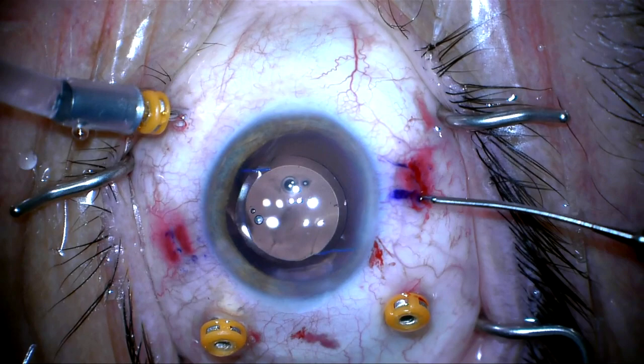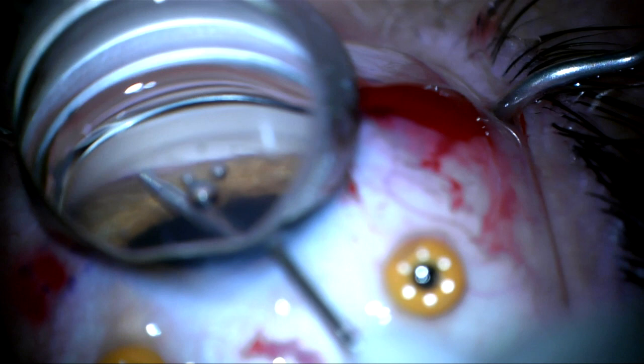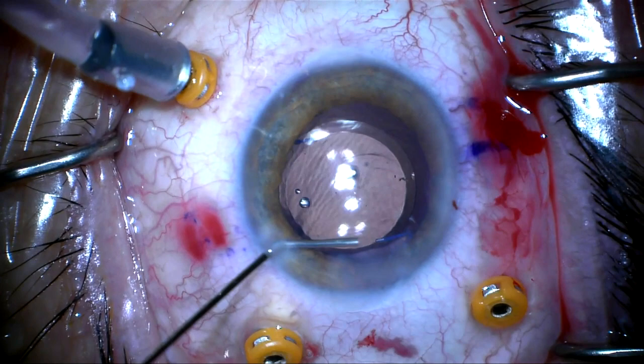I'm now going to place a glaucoma eye stent as this patient does have glaucoma. The stent is placed in Schlemm's canal and released. I'm now going to put a miotic in the anterior chamber to bring down the pupil. This patient already had a pre-existing peripheral iridotomy, so I did not need to perform one.